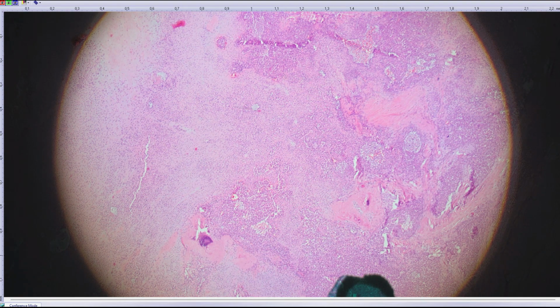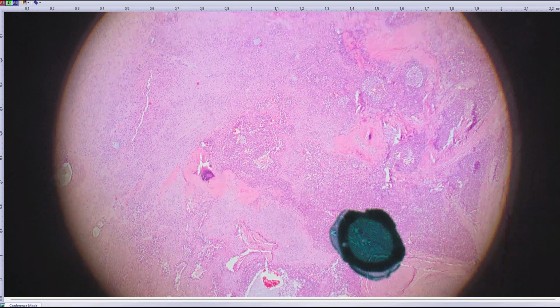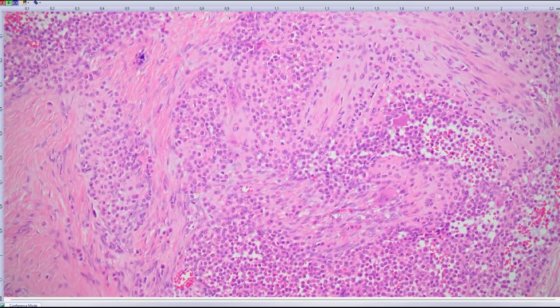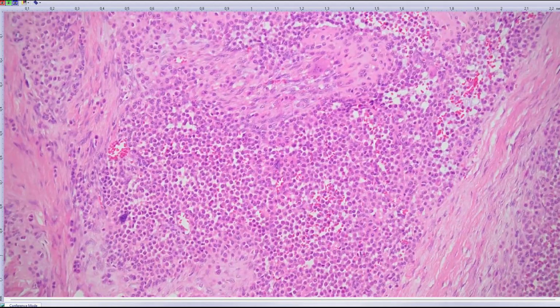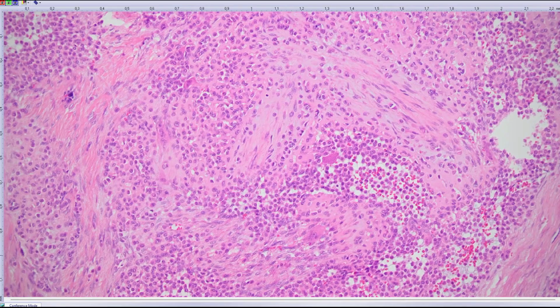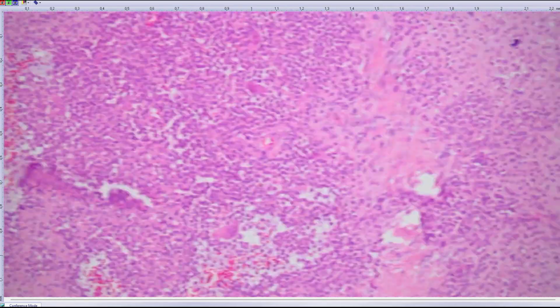So we had a diagnosis of chondroblastoma, and we looked around and asked some experts as well. I think it was consulted with Raoul Perret, if I remember correctly, and they told us that in flat bones, such as rib and others, you can see this pushing extension into soft tissues, and it's fine. It doesn't mean it's malignant, it's still chondroblastoma. Also here confirmed by molecular genetics.